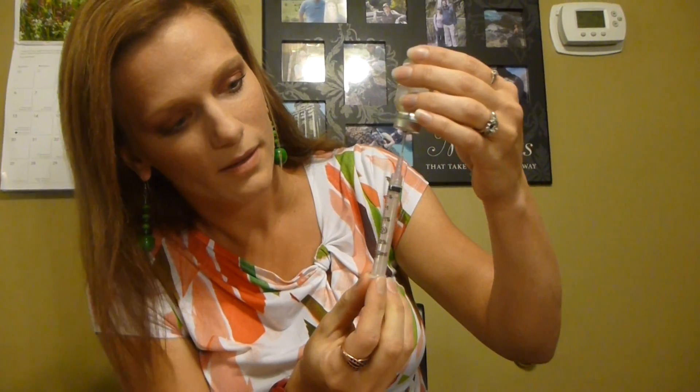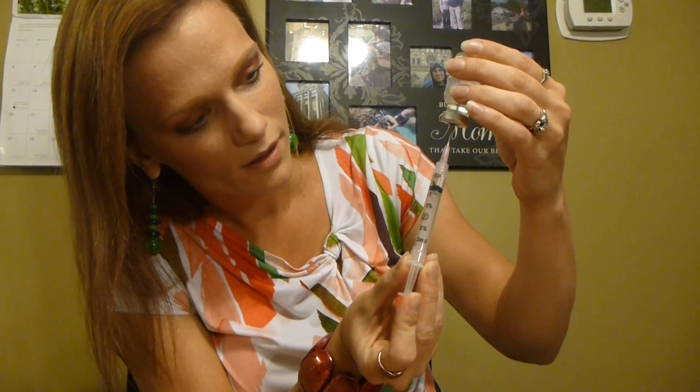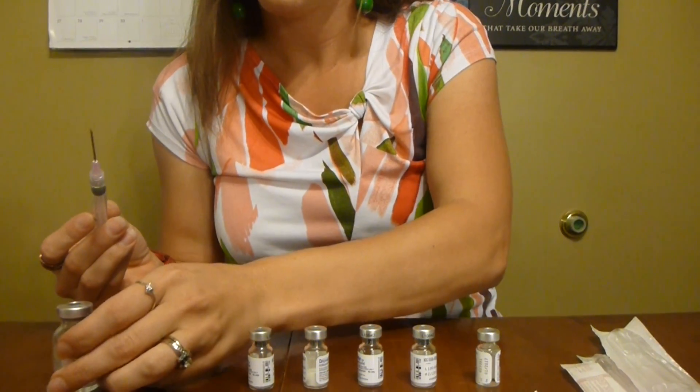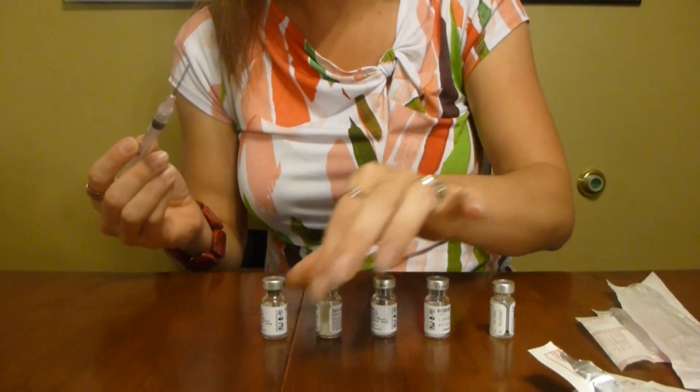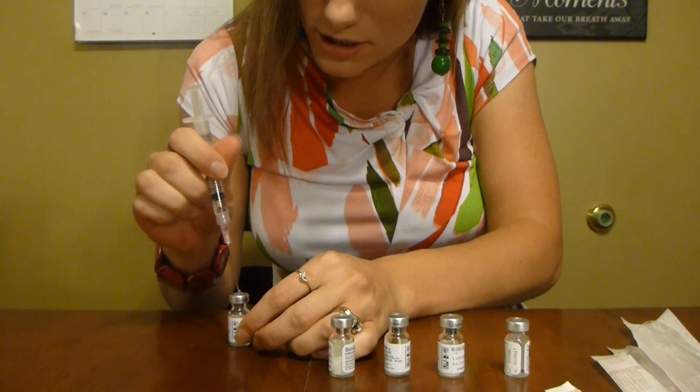I'm going to get my HCG out first. I'm going to draw that down to about half a milliliter. There's a little bit of air in there but that's okay. Then I'm going to set that aside — I'm done with that — and I'm going to put it into my last FSH jar.